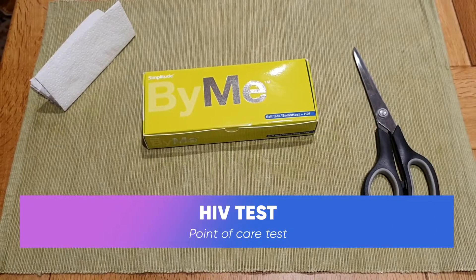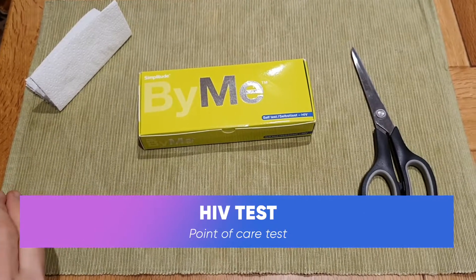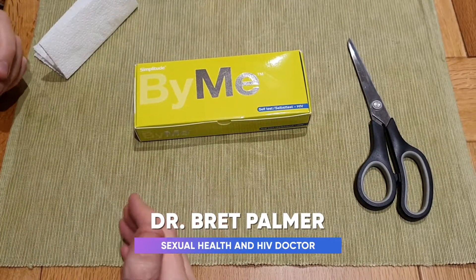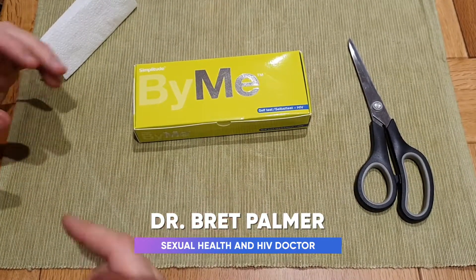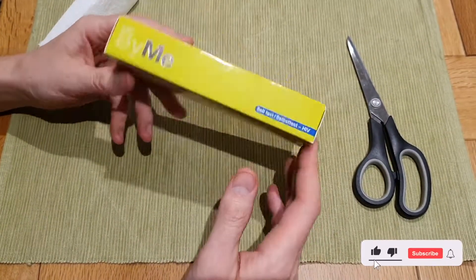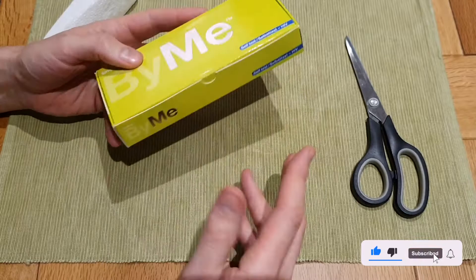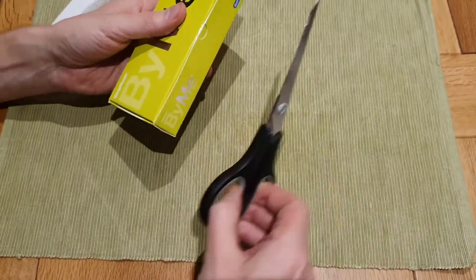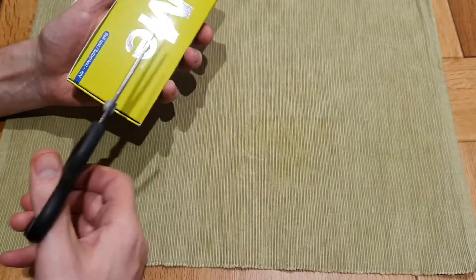Hi everyone, so I've been asked to give my opinion on this test. This is a HIV test from Simplitude. This is a point of care test, and it does seem that a lot of tests now from various services will be point of care tests — this is like a future thing. The Simplitude HIV test is 99.6% accurate.